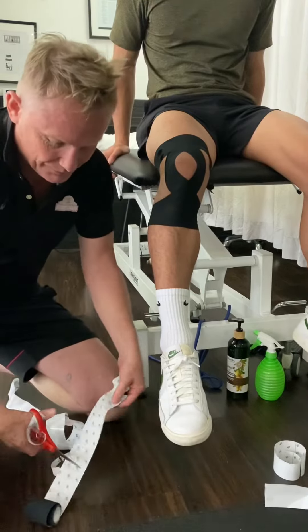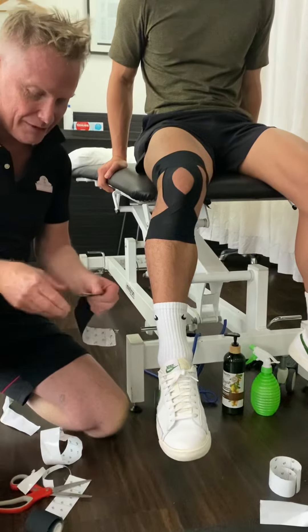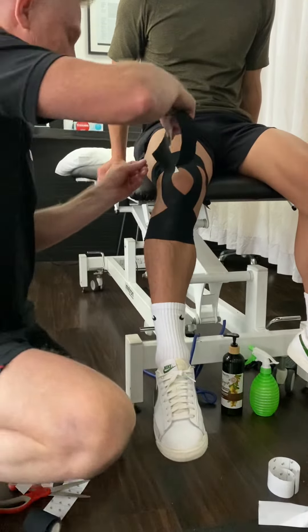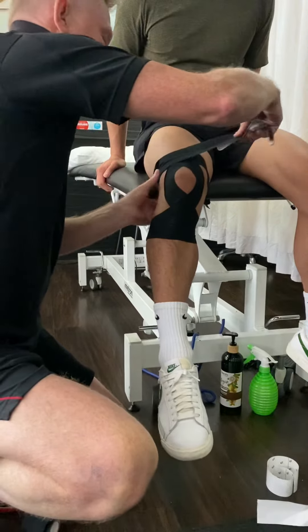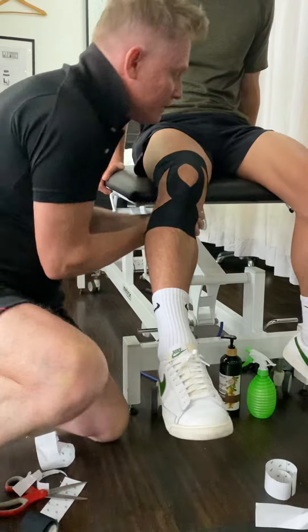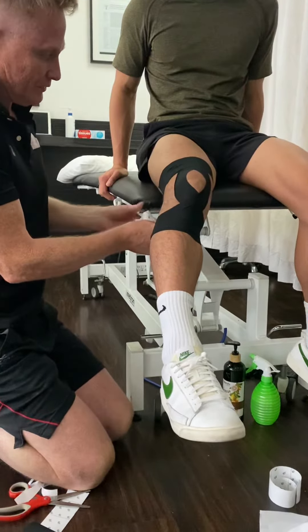Otherwise, a lot of the instructional videos you see in regards to kneecap taping, you've got to go all the way around the back because otherwise it just comes off and it's pretty useless. Just bear in mind when you're playing a game of basketball or netball, it's going to stay on there for probably about an hour.